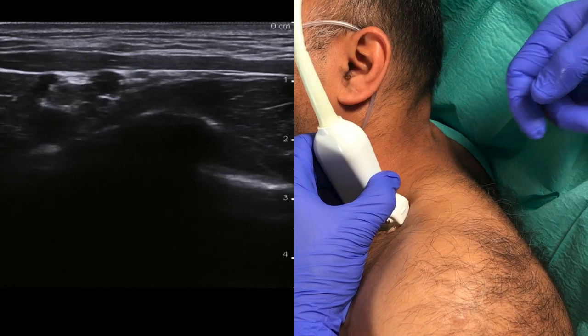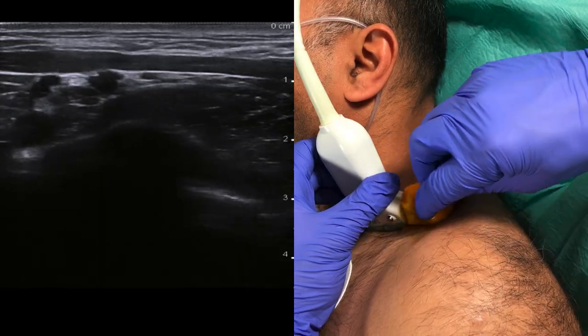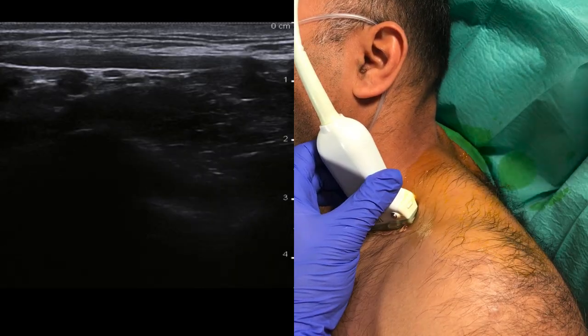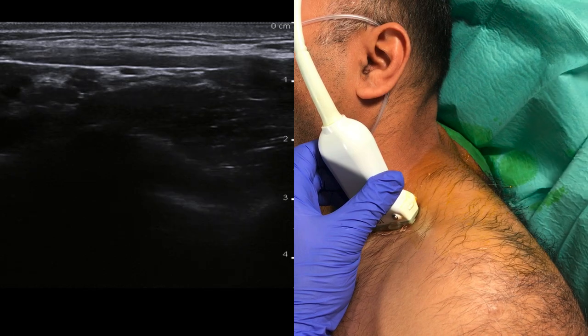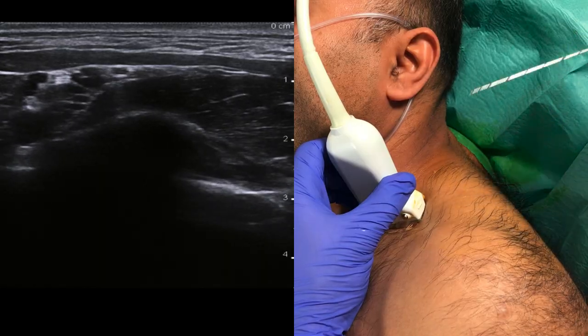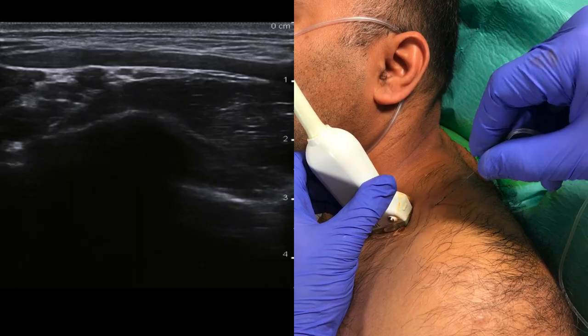Prep the area with an antiseptic solution according to your local guidelines. The point of insertion will be a couple of centimeters away from the edge of the probe. This keeps the procedure sterile and allows for a shallower angle of approach, which helps visualizing the needle. Puncture the skin and place a small amount of local anaesthetic just at the point of insertion.